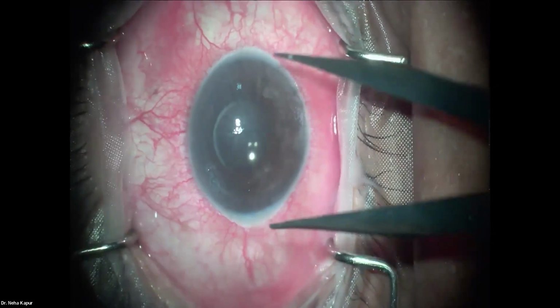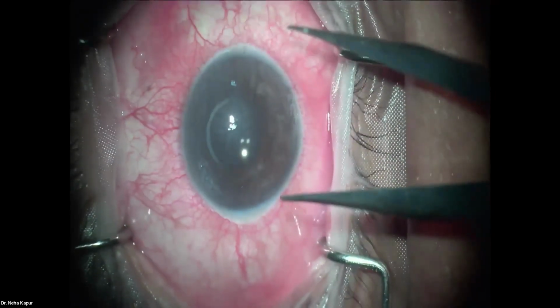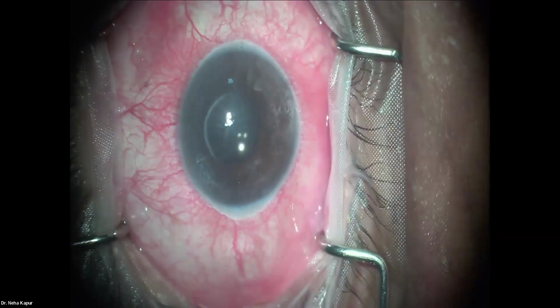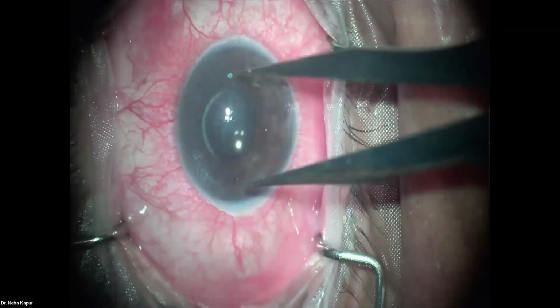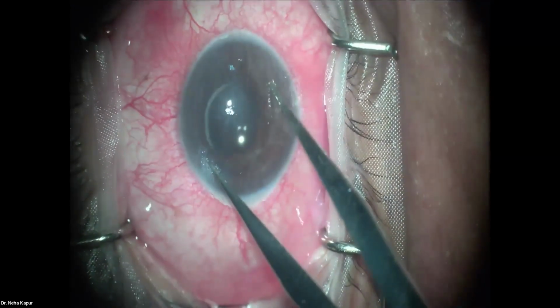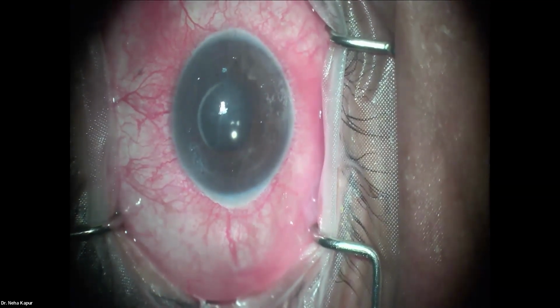Okay, so we'll start now. We start off first by measuring the corneal diameter. And like we said, it's important to see the horizontal white to white diameter. And this being 11, we usually would want to, like I said, not go a lot lower than about 3 to 3.5. So we'll check what a 7.5 looks like on the eye. And it looks very reasonable on the eye. So this is 7.5. So we're going to mark the eye at 7.5 to center our Descemet.